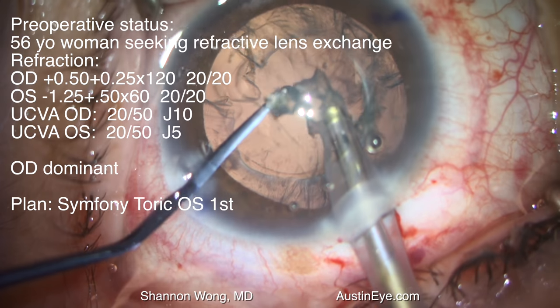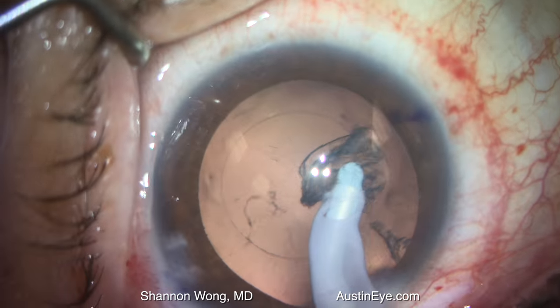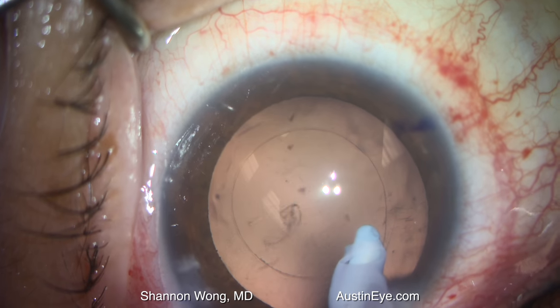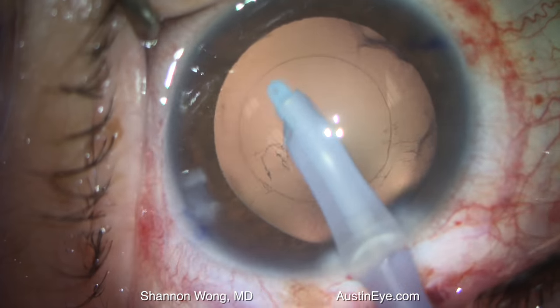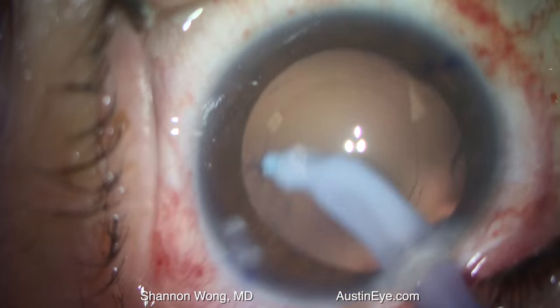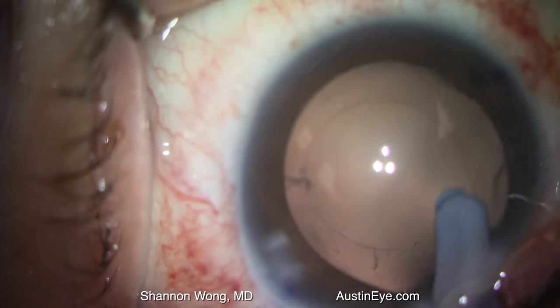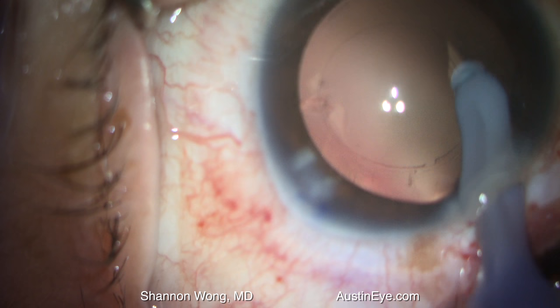The case began uneventfully with phacoemulsification and irrigation and aspiration. As we polish the posterior capsule, you will see the formation of a small striation, which represents adhesion between the silicone tip irrigation and aspiration instrument and the posterior capsule.